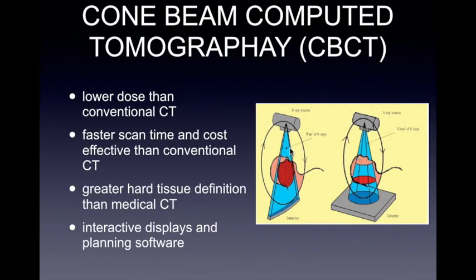The difference, however, is that in a medical CT scan, like what I've said earlier, it would have a fixed size detector that would only detect a certain point of your X-ray. And therefore, it provides consistency because it will get the same area or utilize the same radiation dose every single time.